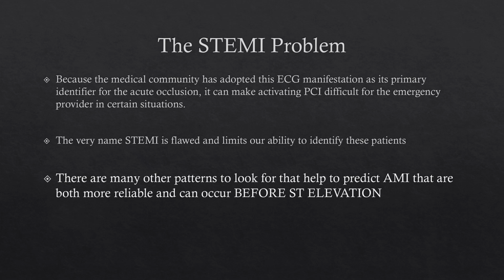If you're seeing some of these ECG patterns that we'll be talking about, and you're working in a facility or on an EMS unit that doesn't have that capability, it can help triage those patients so that we know how to prioritize and where to get them. It may not even be that important that we're activating as much in that patient group as it is just getting them to those facilities and doing serial ECGs, looking for changes, and when they reach that critical threshold, then we can get activation, versus just chalking it up as an air-quotes normal ECG and letting them sit at the wrong place or taking them to the wrong place, which of course would worsen mortality and the outcomes for our patients.